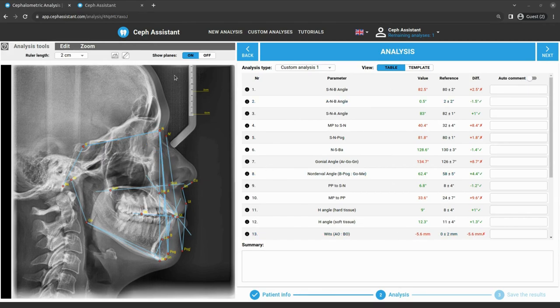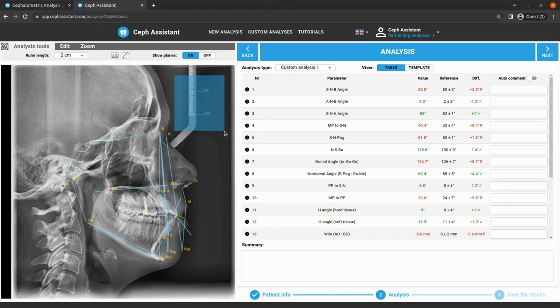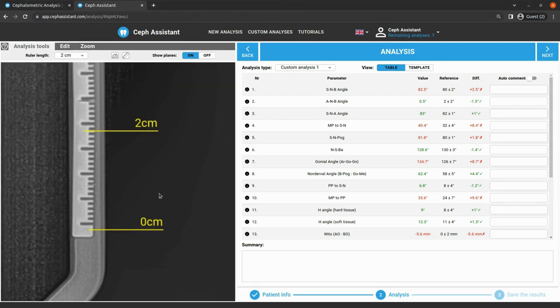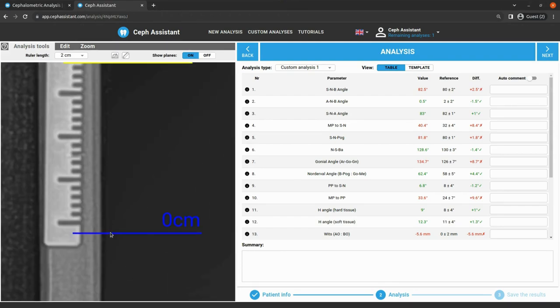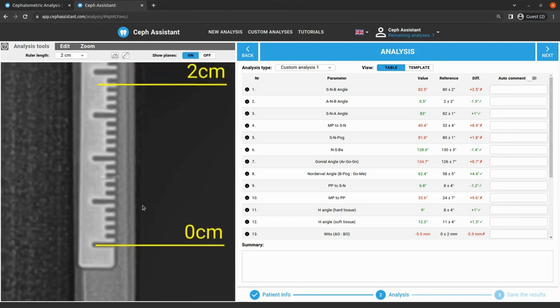First of all, for these measurements the image should be calibrated, so don't forget to adjust the reference points of the ruler.